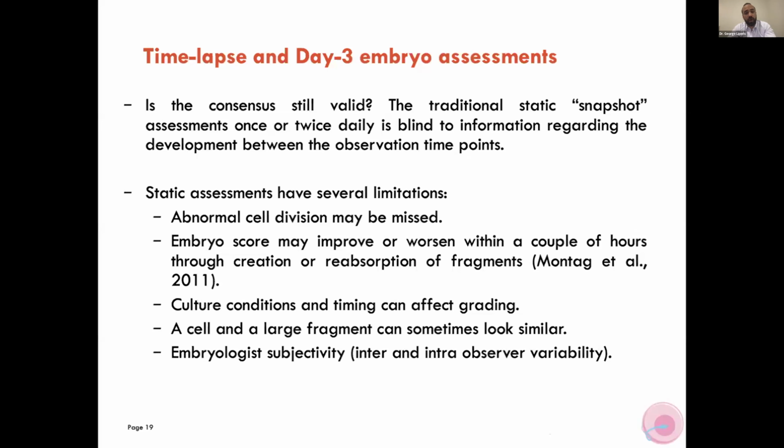There is also embryologist subjectivity. We know that as embryologists, we have inter- and intra-observer variability. There are a number of studies that show this. So different embryologists can grade embryos differently, or even the same embryologist can change their grading over time of the same embryo.